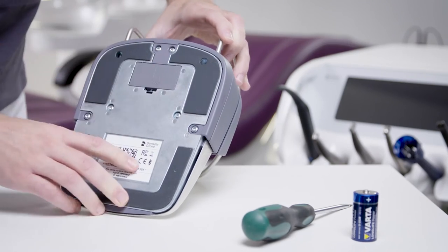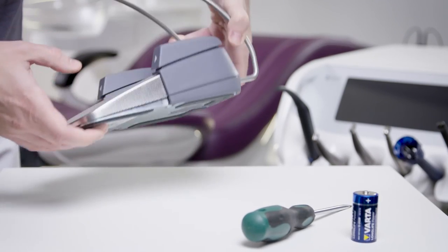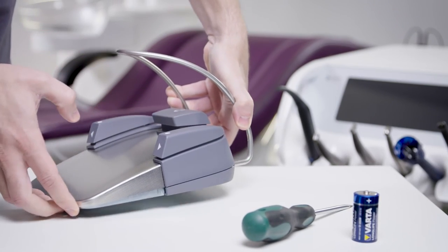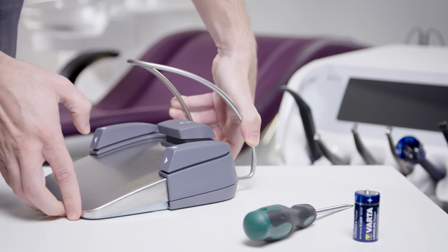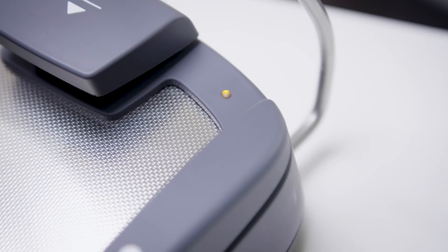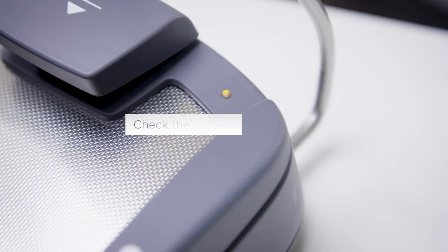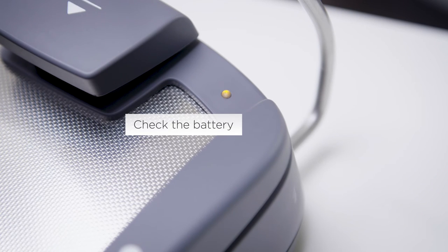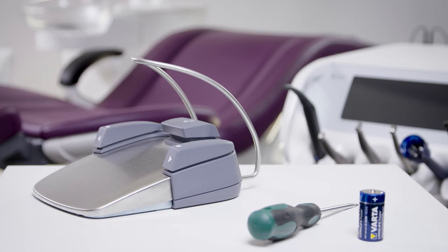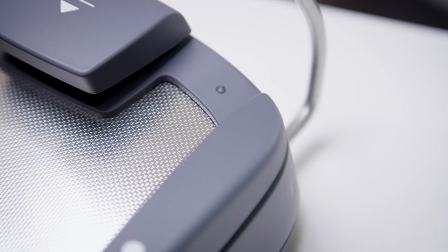You can then check the battery level once again. If the yellow LED lights up for approximately 10 seconds directly after insertion, the battery is okay. If the LED flashes after insertion, the battery is too weak.